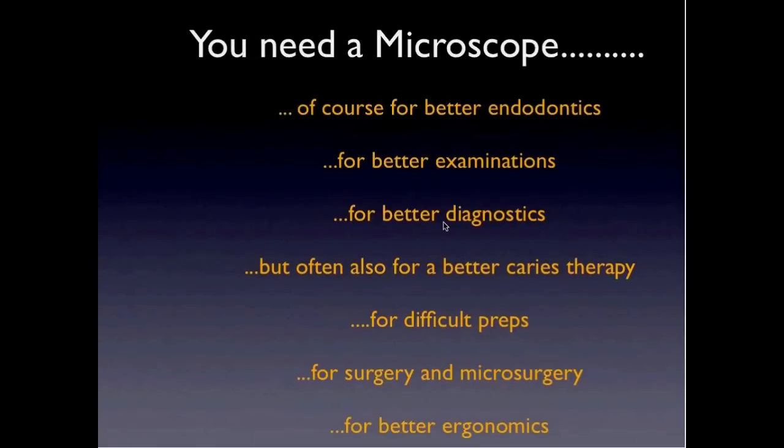You need a microscope, of course, for better endodontics, and you need it for better examinations, which lead you to better diagnostics. But very often also for everyday work, like a better caries therapy, better fillings. I use it almost every time I'm doing a prep, not only for difficult preps, but every time. I use it for surgery and microsurgery, and also for better ergonomics, because my back is still okay after 40 years of dental treatment.